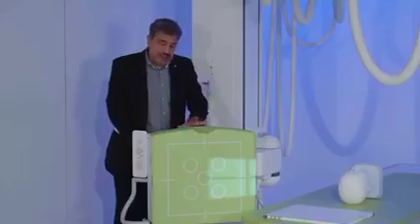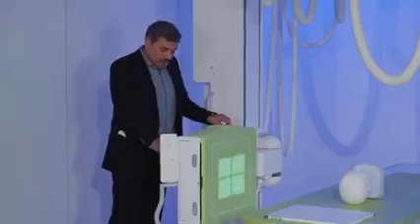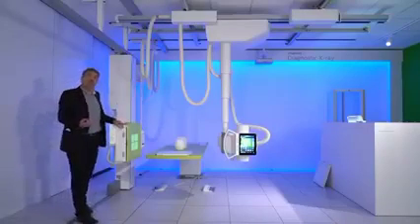Up to 45 degrees in this way, up to 25 degrees in that way. So also there, a movable wall stand will help you to make your exposures in a better way, independent of what kind of cross-table lateral exposure you need.